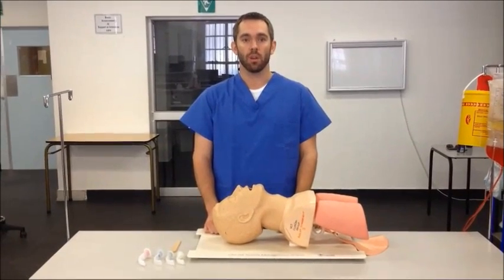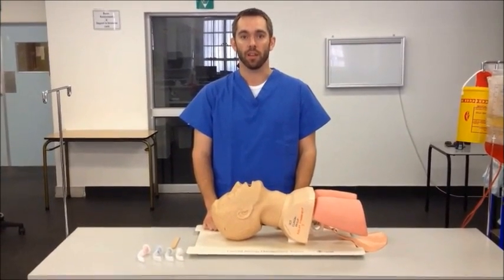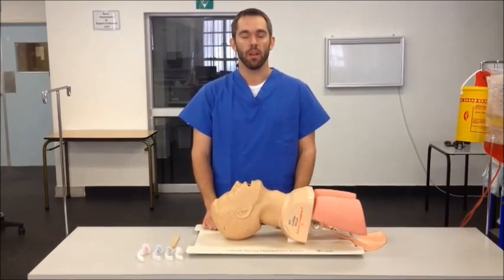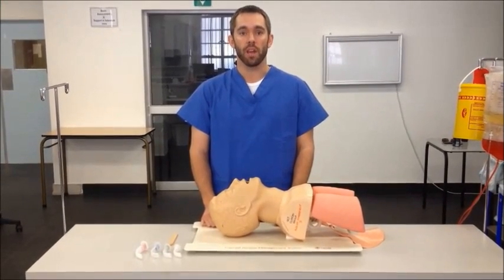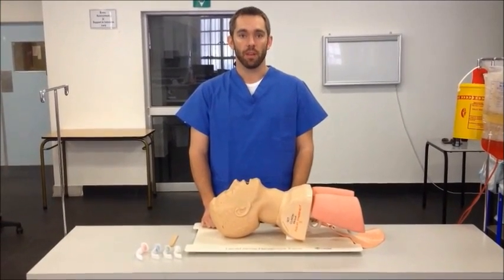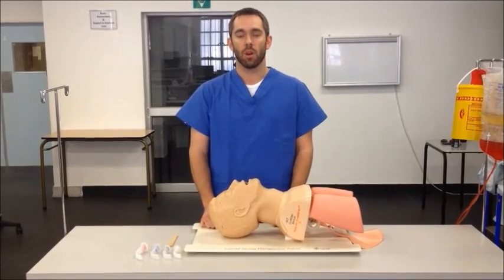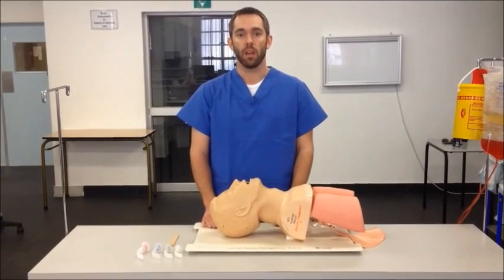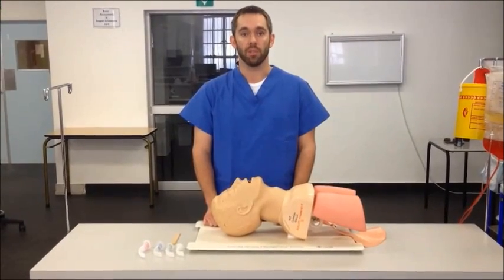The correct insertion of an oropharyngeal airway is an adjunct used to prevent or treat airway obstruction caused by the sagging or collapse of upper airway soft tissue.